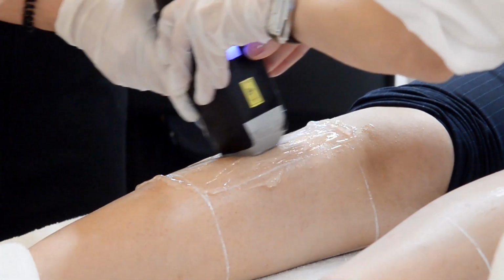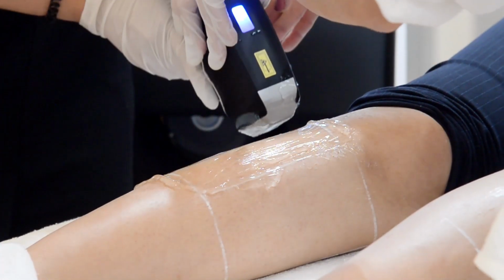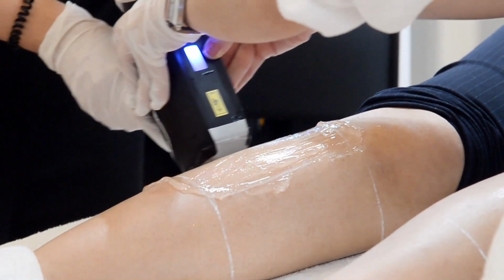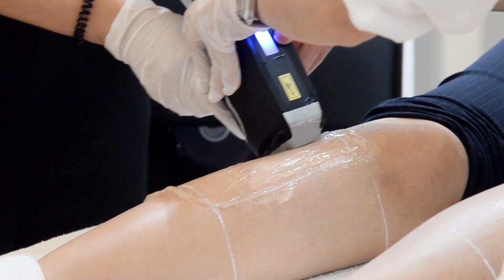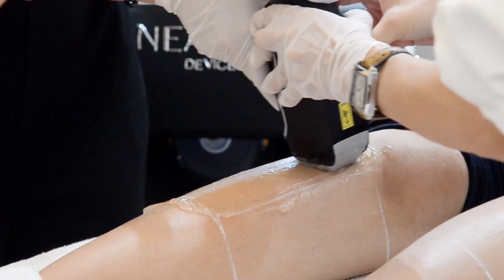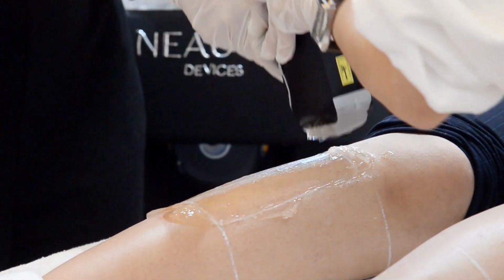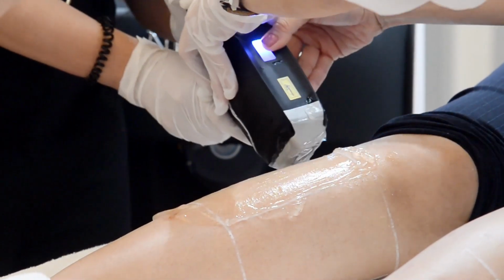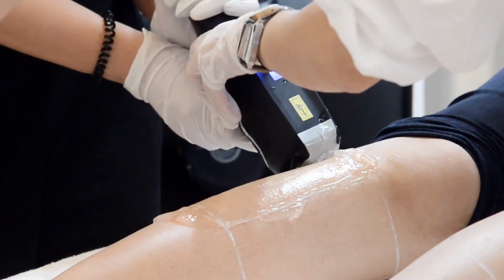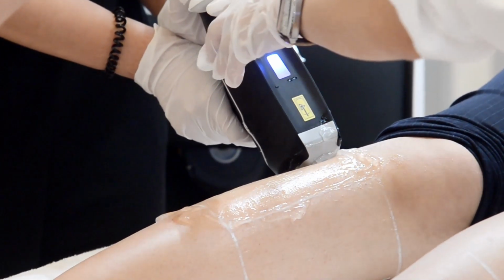Is it okay? If you're okay, then you will start from here. You will move according to this row. Okay? Let's try. If you're ready, then you can start to press and hold the button and then move the device.